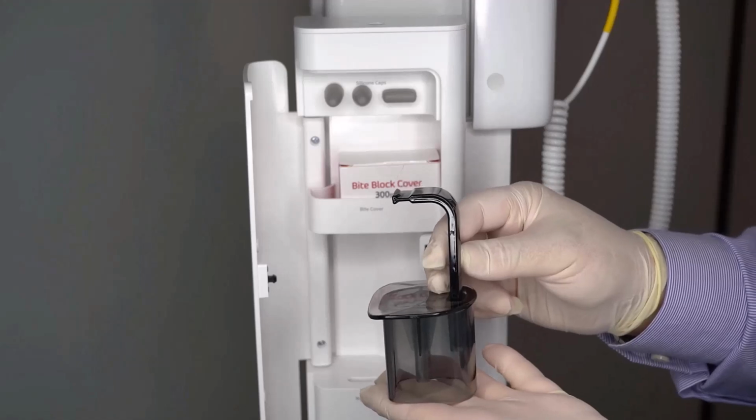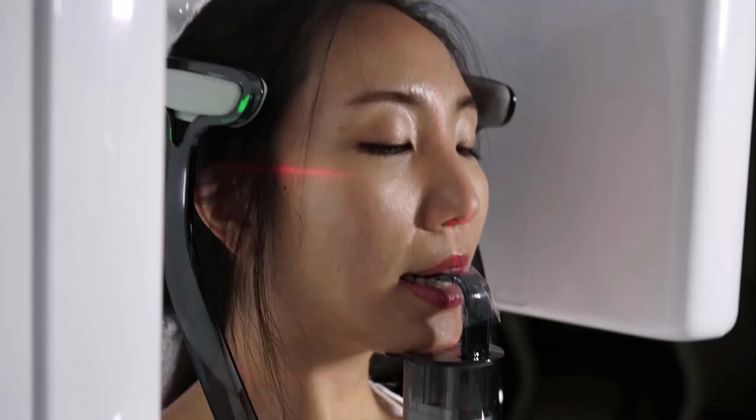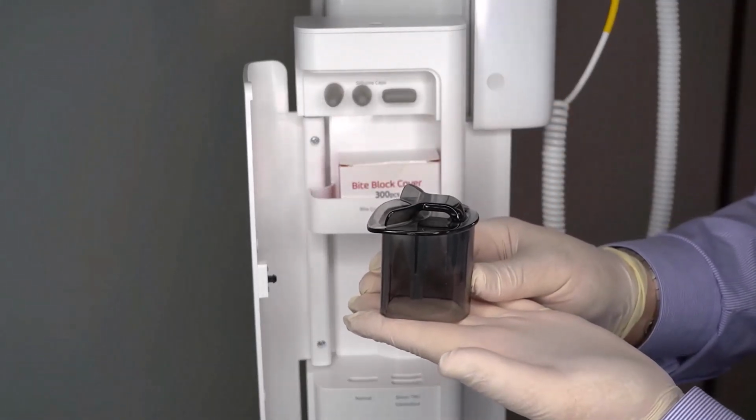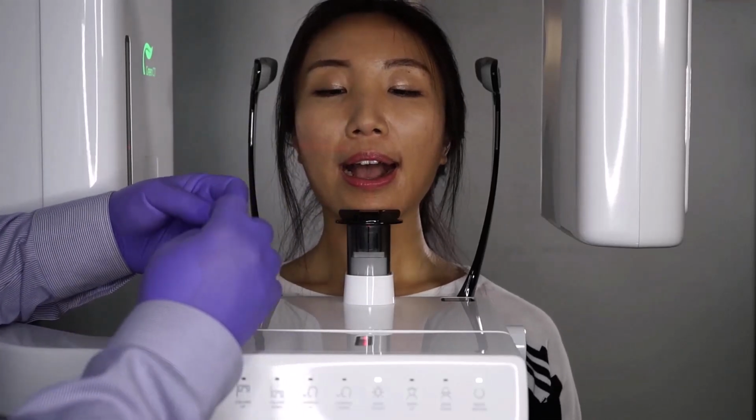Chin rest with normal bite stick. Special bite B or edentulous rest. Additionally, use a cotton roll to separate the bite.